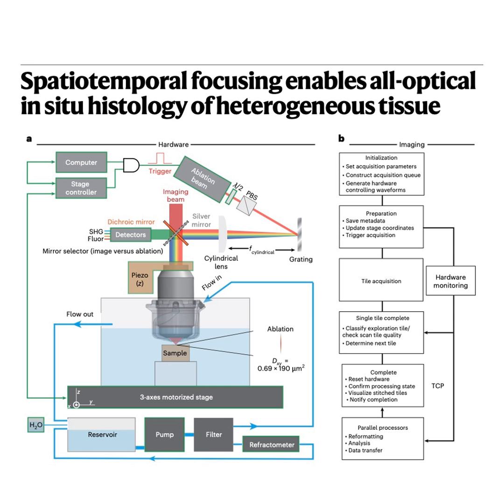Extremely short. Vanishingly short. And when these intense pulses hit the exact focal spot in the tissue, the energy density gets so high that the tissue absorbs the light through nonlinear absorption processes. Nonlinear absorption, so it's not just simple heating like leaving something in the sun. Not at all.